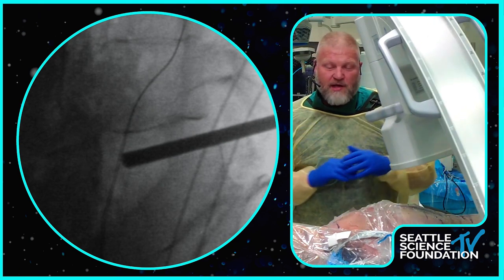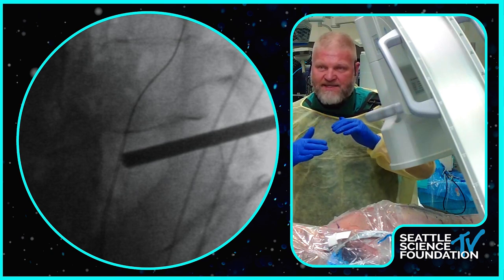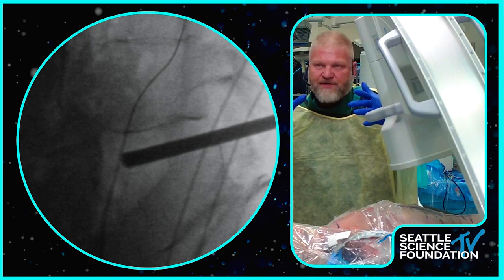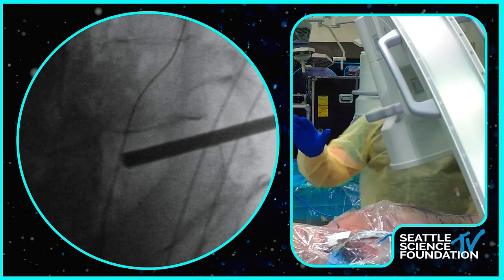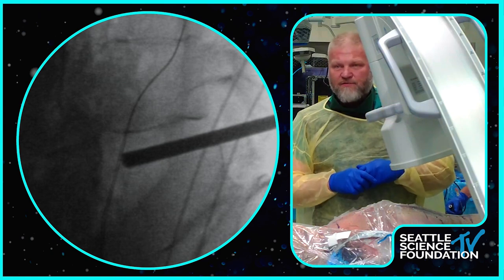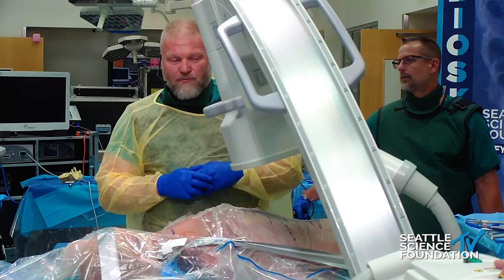So ultimately, what I want is, on the lateral view, to fill my disc, and on the AP view, I want my implant to go from medial wall of pedicle to medial wall of pedicle, so it's obliquely the largest surface area it can be. So I put the needle in under AP imaging. However you do this, do it the same way every time. The way you do your needle insertion for transforaminal, that's how you should do it. But I'm going to guess on where this should be.